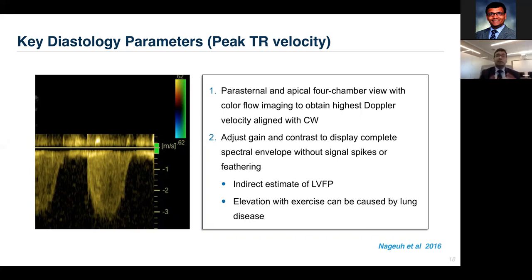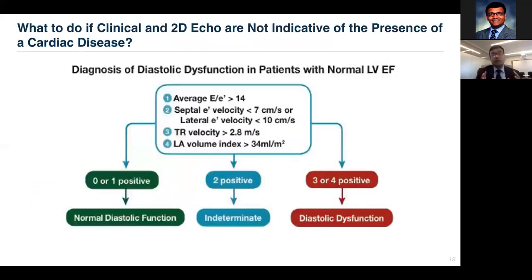Particularly, an elderly individual can have both diastolic dysfunction and lung disease, and this concomitant information may therefore many times be confounded. And for these reasons, the diastolic dysfunction guidelines stressed the consistency of information. So they requested that at least three or more of these variables be abnormal to call it diastolic dysfunction.